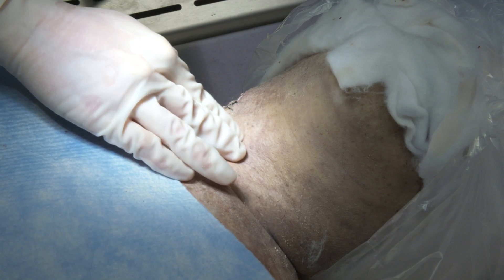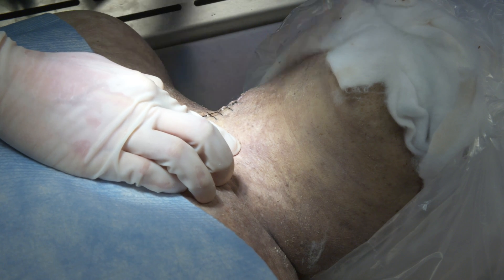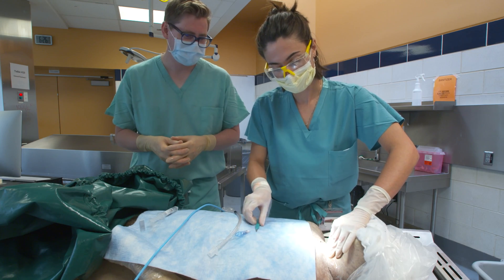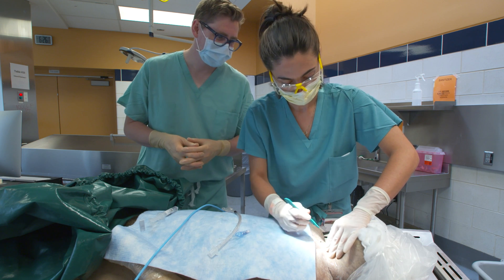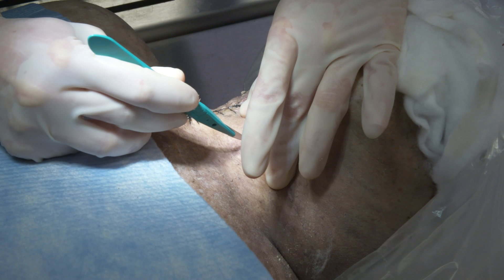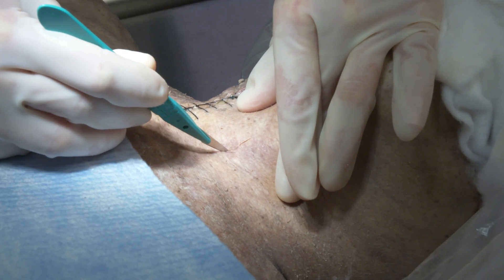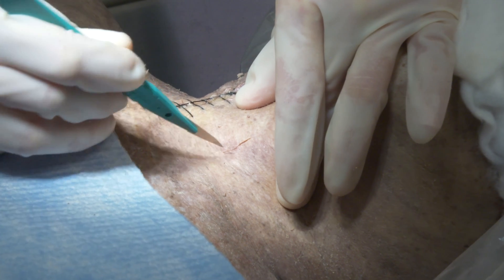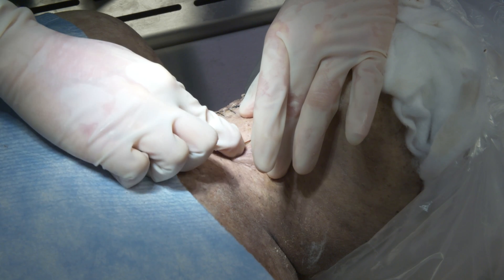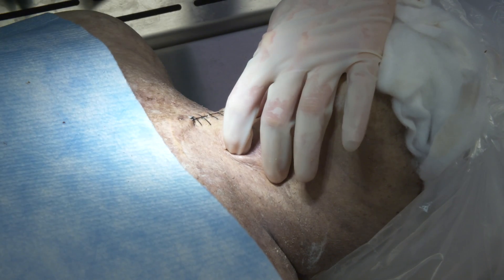First, use your dominant hand and locate the cricothyroid membrane. You can hold and stabilize the larynx with your other hand to help. Next, make a vertical midline incision in the skin over where you felt the cricothyroid membrane. The length and depth of this incision depends on the situation, but it is usually at least 2 centimeters in length. Palpate again within the wound with your finger to confirm the cricothyroid membrane. If you need a bigger incision, extend what you have with the scalpel.